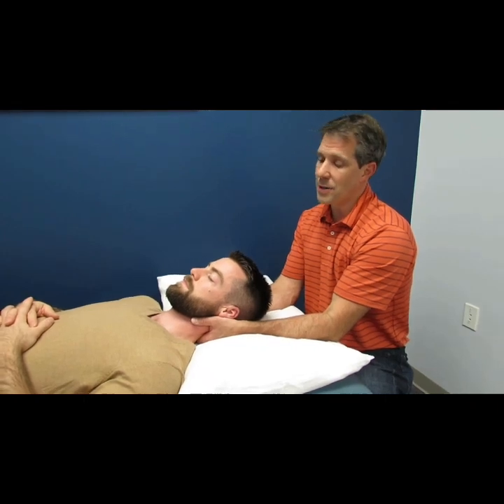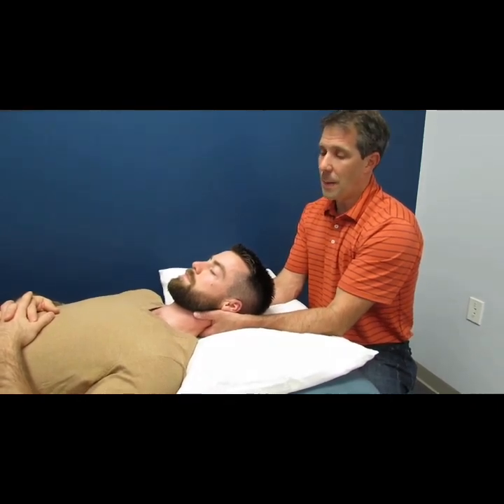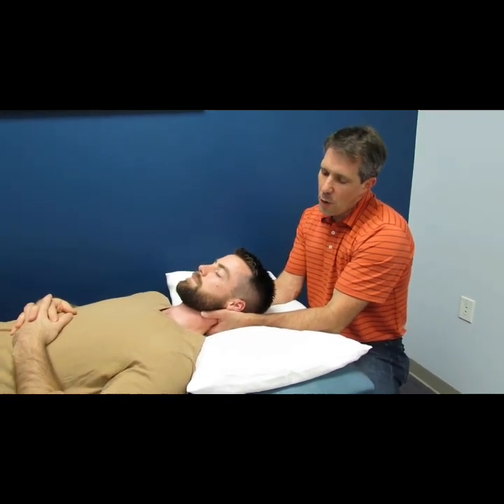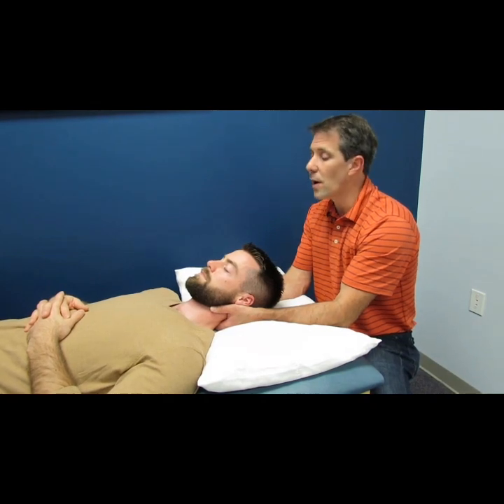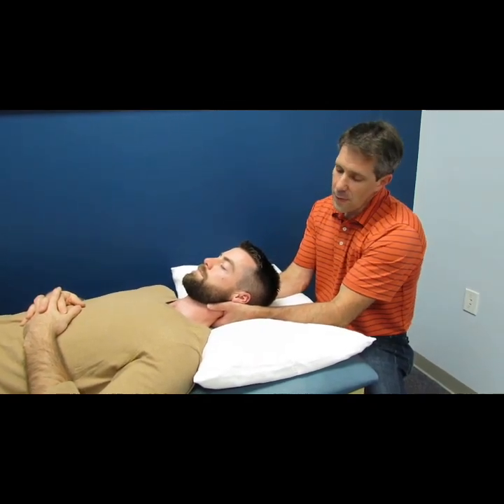Now I can't measure this, okay? It's not like a dynamometer where I can check how many pounds I'm pulling, but you get a feel after you've done enough of these to know how much to pull. And so I like to pull between 15 and 20 pounds. How you doing so far? All right. I think he's already sleeping.